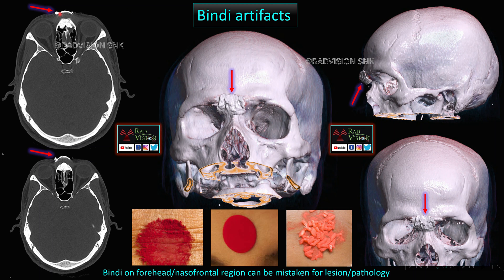Next case: there is a hyperdense area noted in the forehead and nasofrontal region with a dense artifact. On VRT reconstructions, the lesion is clearly seen outside the bone, not attached to it. Retrospectively, this was found to be a large bindi or kumkum kept traditionally on the forehead. Sometimes turmeric and rice can be mixed and applied as tilak, and these can produce artifacts and mimic pseudo lesions.